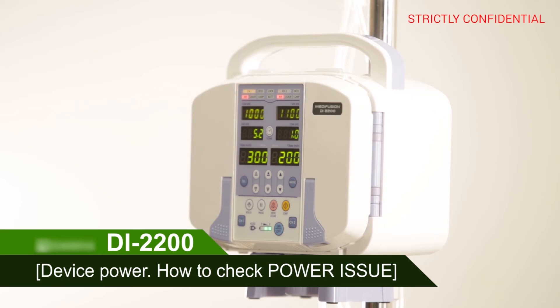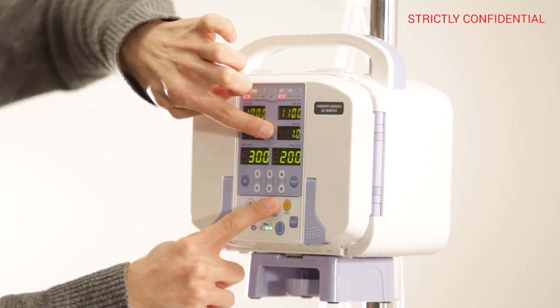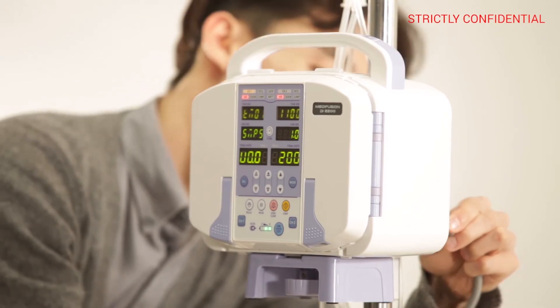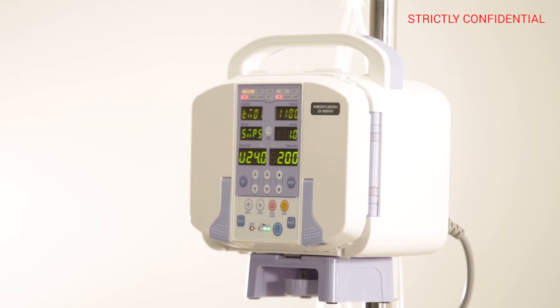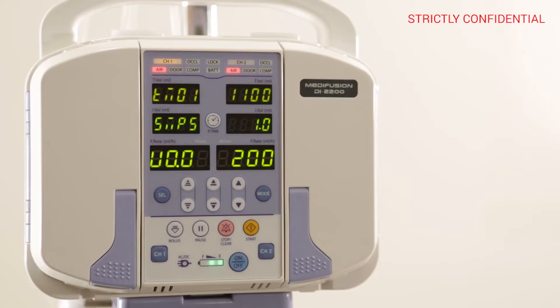How to check if infusion volume was not proper. Press the R-TIME and STOP button at the same time for 3 seconds to enter the service mode. If the voltage value on the third display increases from 23 to 24 when the power cable is installed at the back of the device, and if the value drops to zero after powering off, it is NORMAL.